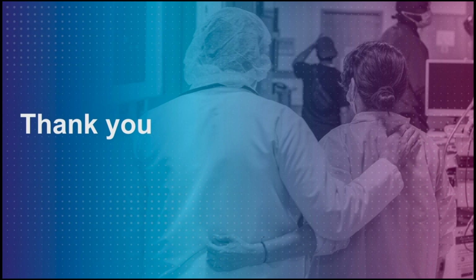I think it's critically important to partner with your nuclear medicine physician or radiologist when getting this program going. It has a learning curve to it. You're going to need to see a lot of scans, and probably the best way to do it is to image patients and take them to the operating room, and then you're basically doing your own little calibration experiment to know what an oncocytoma looks like and what a clear cell looks like.